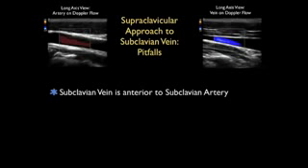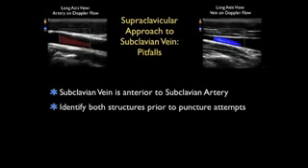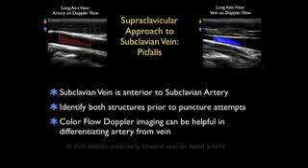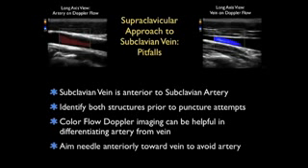A second potential complication is inadvertent puncture of the subclavian artery during the cannulation procedure. Remember that the subclavian vein lies anterior to the subclavian artery, and we can identify both structures prior to puncture using ultrasound. We can use color flow Doppler imaging to differentiate the artery from the vein — we can see the pulsations within the subclavian artery versus the venous hum within the subclavian vein. We want to aim the needle anteriorly at all times to avoid inadvertent puncture of the subclavian artery.